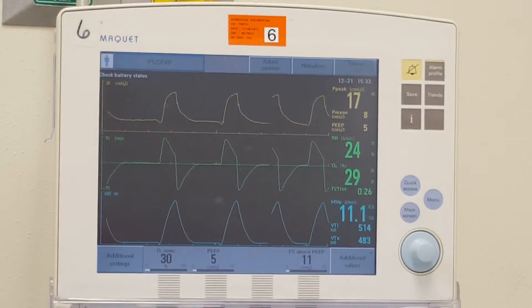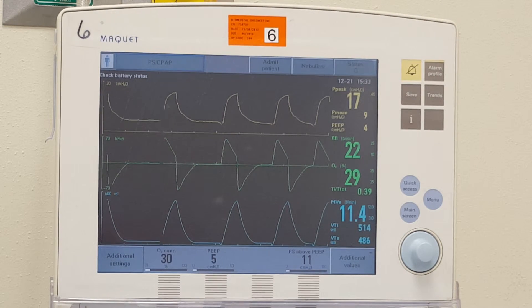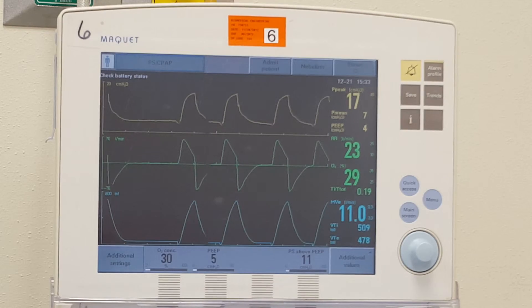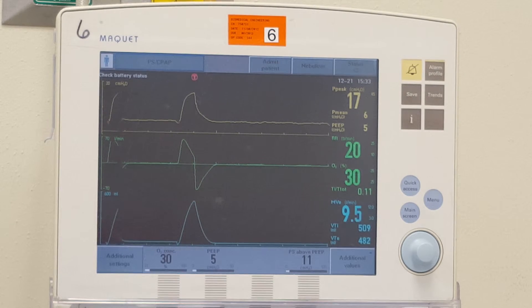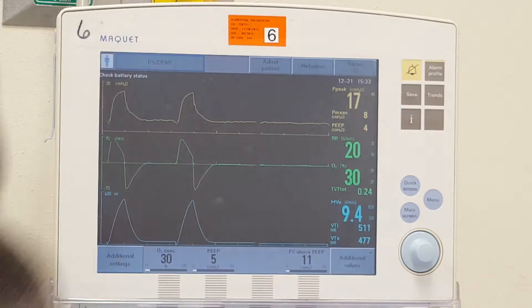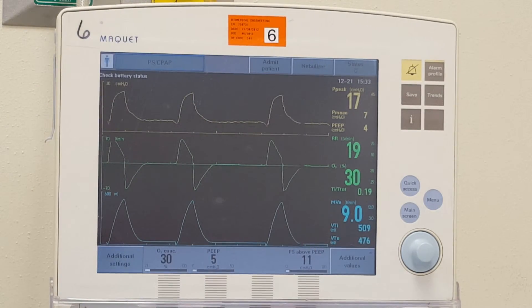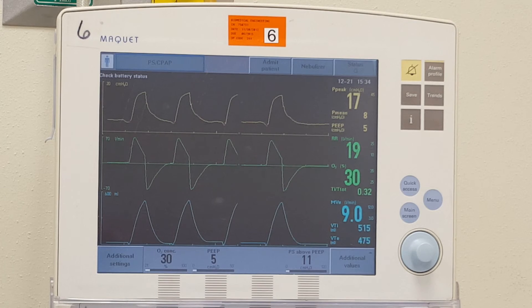When we did volume support, instead of us having to titrate pressure support, the ventilator automatically did it. We told it how much volume we wanted, and then it gave enough pressure support to achieve that volume. Here, I had to manually figure out how much pressure I needed to deliver that tidal volume. And of course, if the patient's compliance or airway resistance change, that will impact it.